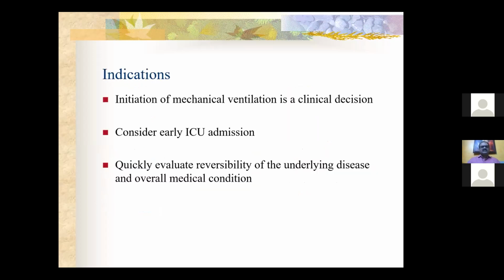If you take the indications of mechanical ventilation, basically, initiation of mechanical ventilation is a clinical decision. It's the same as non-invasive. When the patient comes in, we'll be seeing the patient, assessing the breathing and other parameters, and then taking a clinical decision whether we are going to intubate or not, or whether we are going for invasive or non-invasive ventilation. In any case, if the patient needs ventilation based on clinical aspects, early ICU admission should be done. We shouldn't waste time in the ER or in a ward.